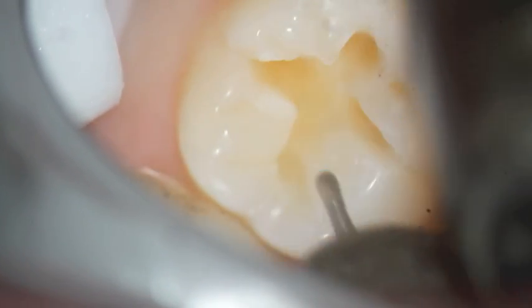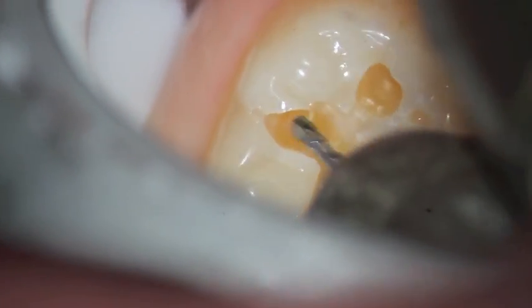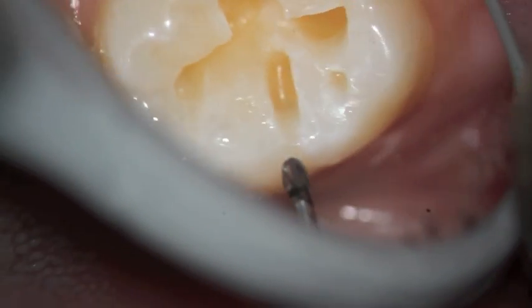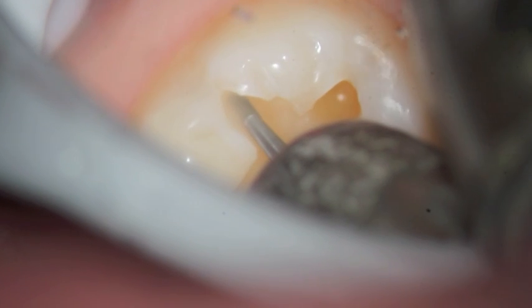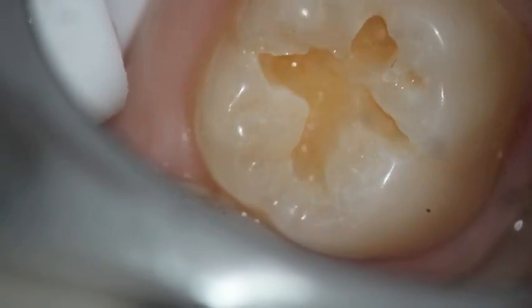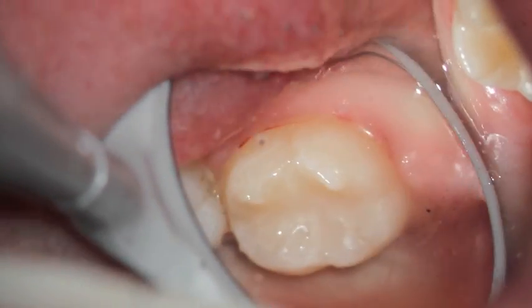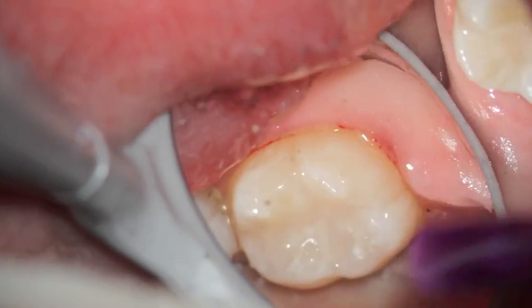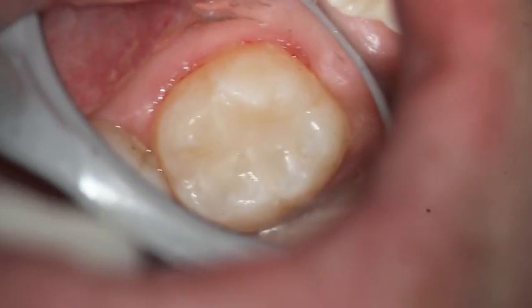And so it's important to spend the extra time making sure that the filling is going to be in good shape. Because if this filling breaks, then you already have a hole in your tooth, and it just repeats the cycle. The idea is to spend the time to do a filling like this and have it last for a long, long time. And hopefully we would have done it earlier. But here it is, nicely done.